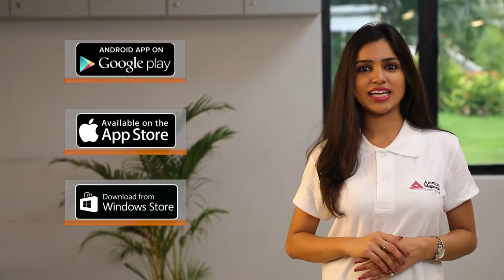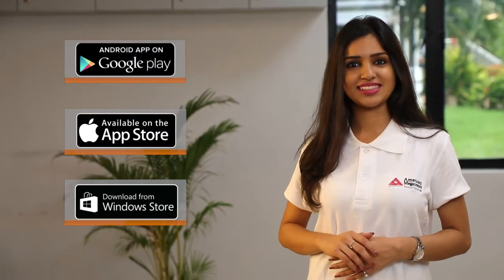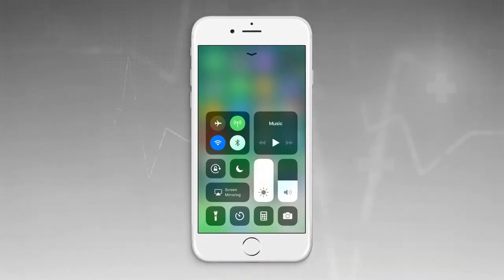Using the Bolt device is very simple. Download and install the Bolt app from the respective app stores. Switch on the Bolt device and pair it using Bluetooth.